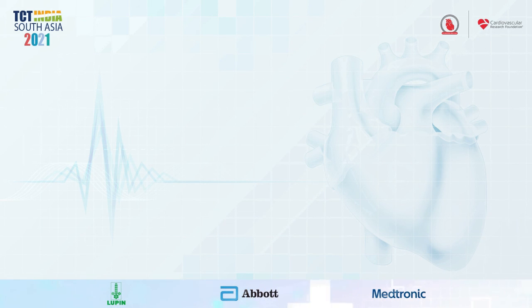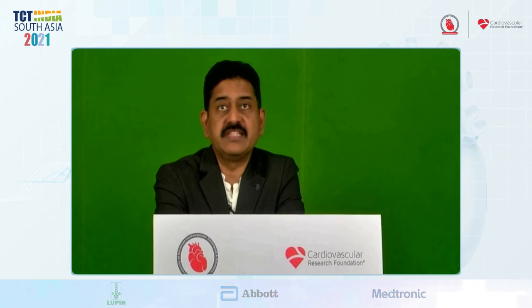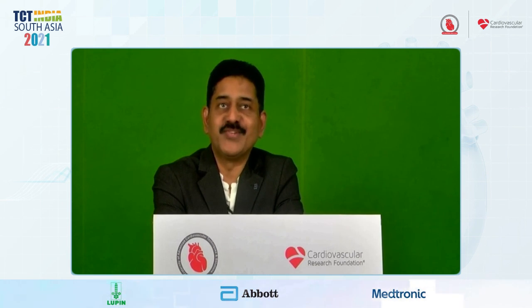Okay, so sir, as we were discussing, we are fortunate to do this live demonstration of QFR, a multi-vessel PCI, at the main TCT from our Apollo hospital last year. And we could finish the entire procedure of all the 3 vessels, including QFR, FFR comparison, and doing a results of PCI. And I'm happy to say that the QFR correlated quite well with the invasive FFR. And the problem of wire FFR also was demonstrated when we injected adenosine, patient got bradycardia and trouble. So it was a perfect case example to show the importance of QFR.